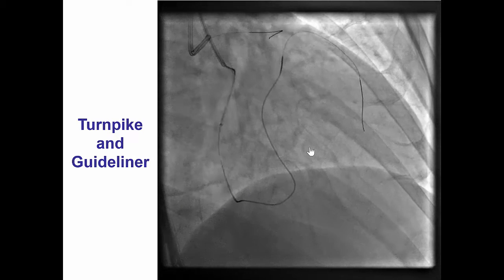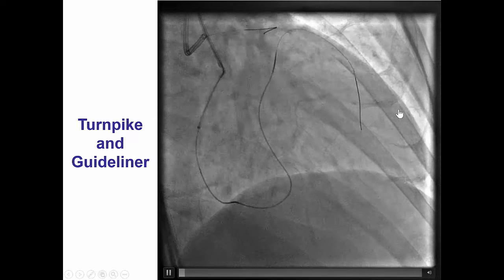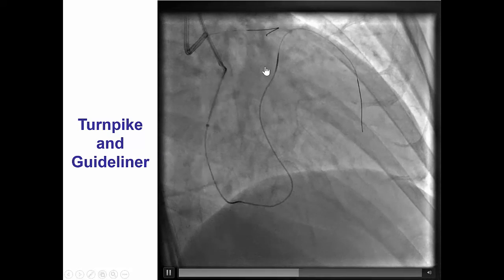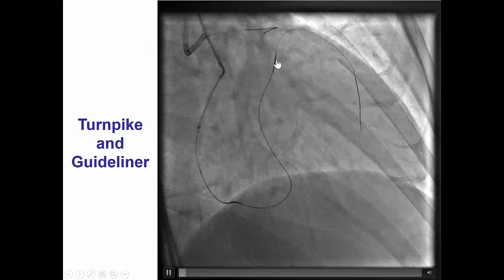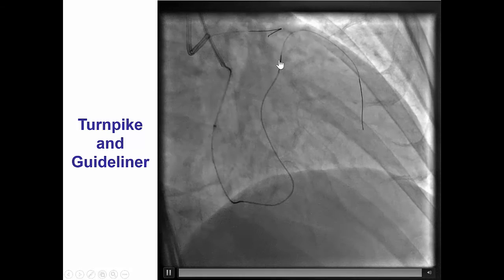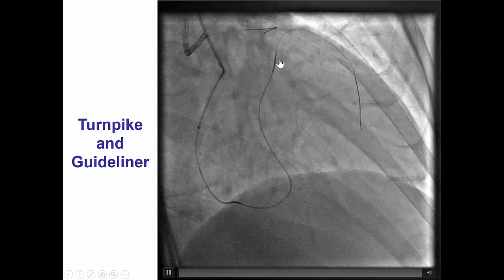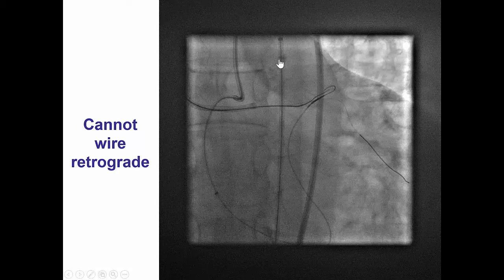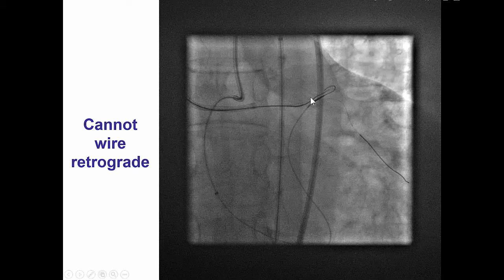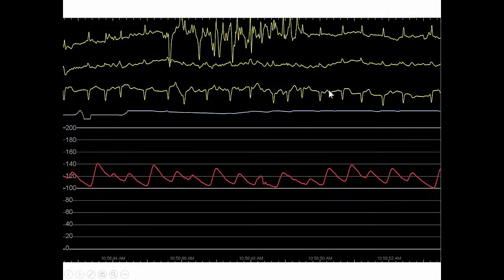The wire, unfortunately, wanted to go distally in the LAD. However, we were able to advance the Turnpike catheter close to the LAD and then try to wire retrograde. However, we were having a lot of difficulty doing that. In the process, we decided to try some antegrade wires using the retrograde wire as a marker to resolve the ambiguity.